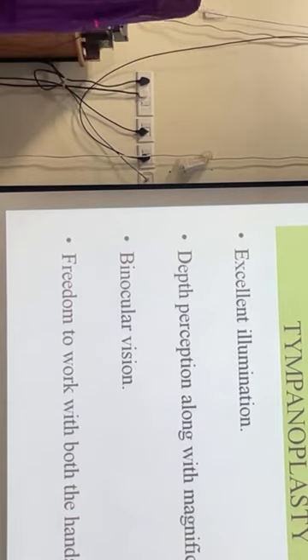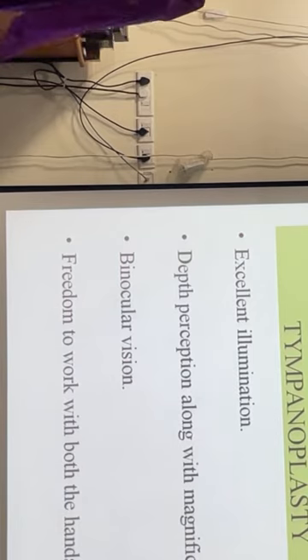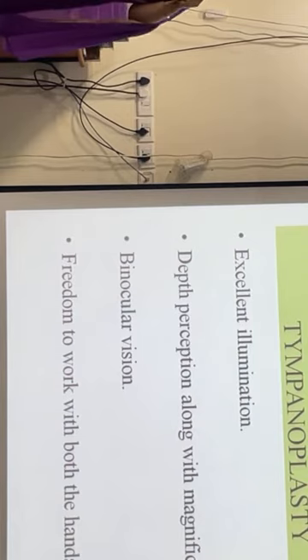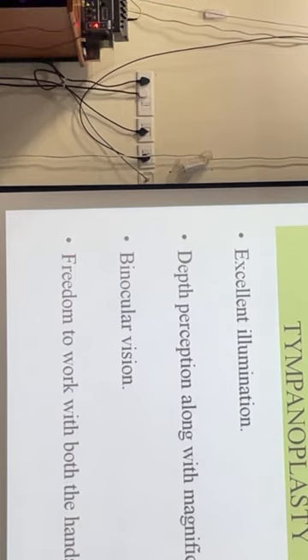Now this is also a very important factor, that one hand of ours is just holding the scope. So the suction of blood, stabilization of the stapes, removal of granulations, which our non-dominant hand is doing, we may feel that handicap, but then again with practice and a calm, composed approach, using digits of the hand liberally, I think with time it will not be that distressing.